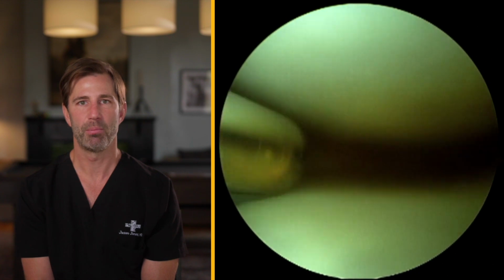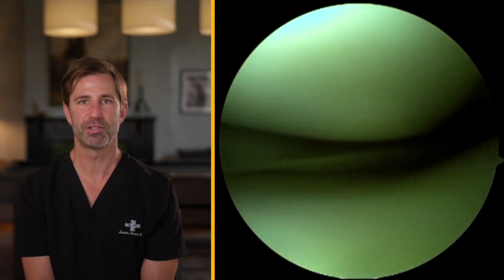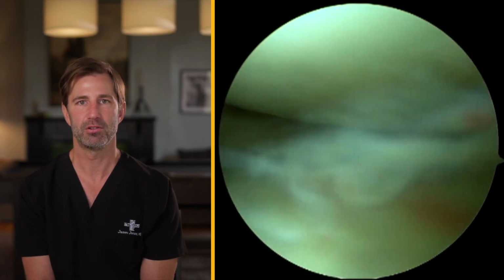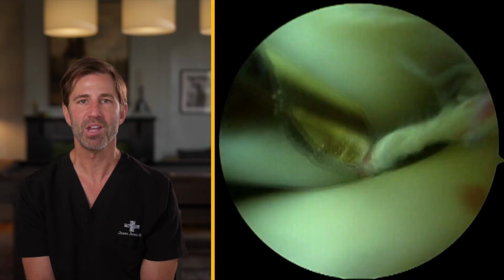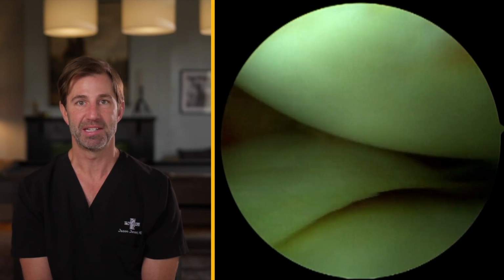Lastly, we'll use a small metal device called a shaver. This is a rotating blade. We can use this to remove portions of damaged tissue or small pieces of tissue that aren't where they're supposed to be. Once we have obtained access to the inside of the knee, we'll check the menisci.